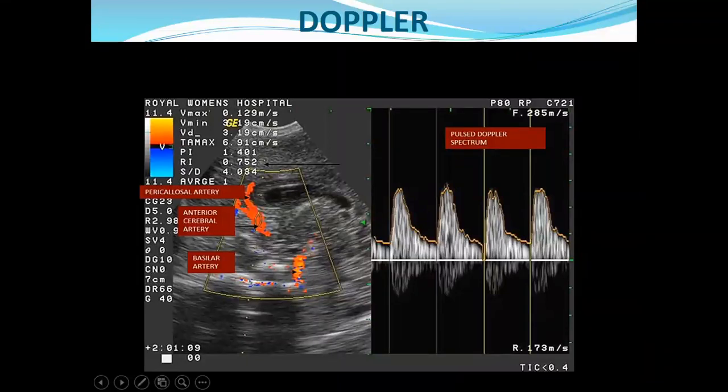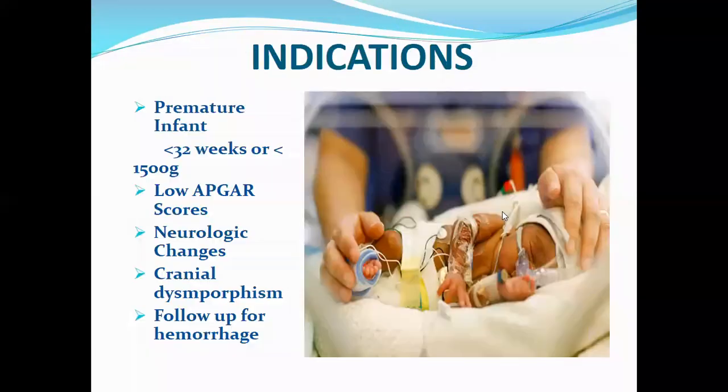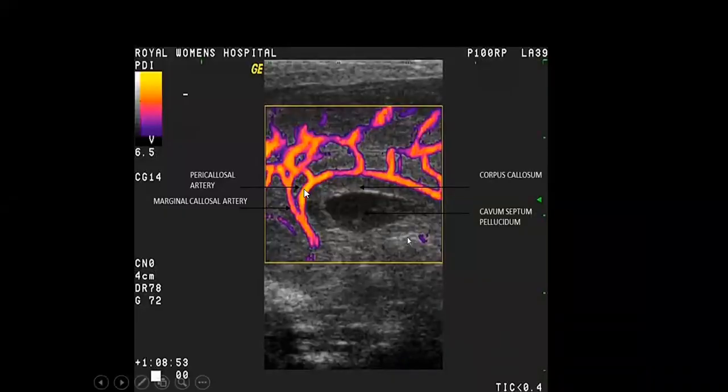Remember, these look like this. I was stressed. These look like this. So sometimes normal color Doppler won't show anything. That is why now you will go to power Doppler. The trade-off here is that it won't show you the direction of blood flow, but it will pick these blood vessels very, very clearly, as it is notorious for picking blood vessels with low blood flow.